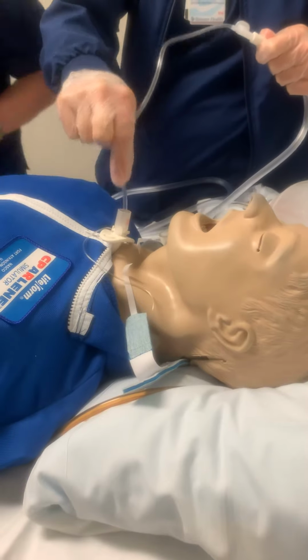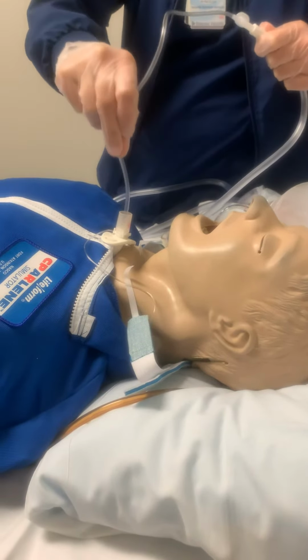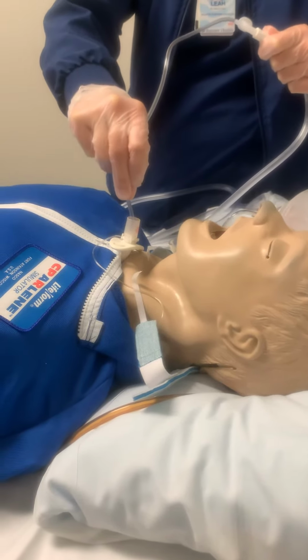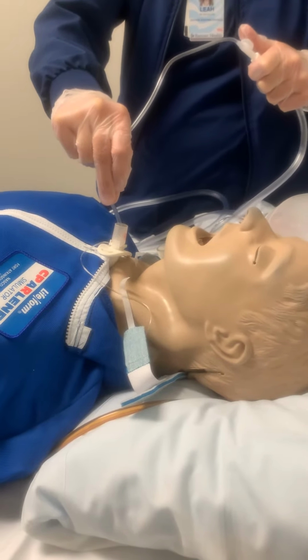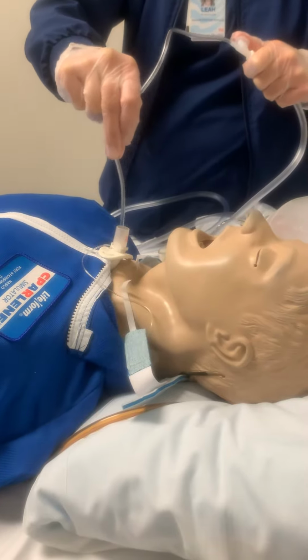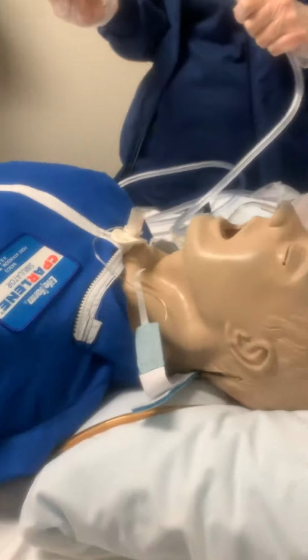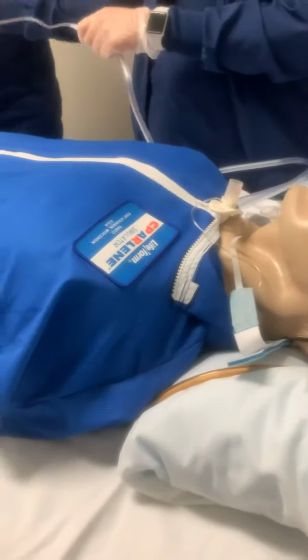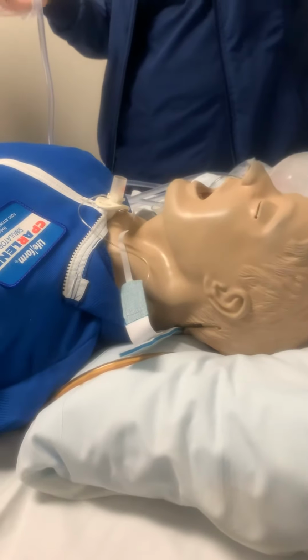Do you feel it? And then come out, just pull it back a smidgen. And then do suction and swirl it out. For how long? No more than 15 seconds. And I would just clear the line with saline again. Go again, however many times they need it.